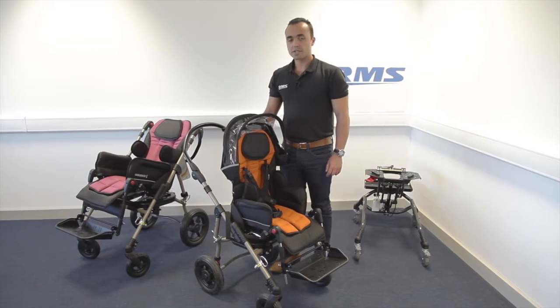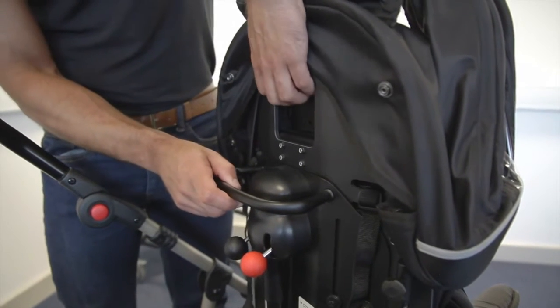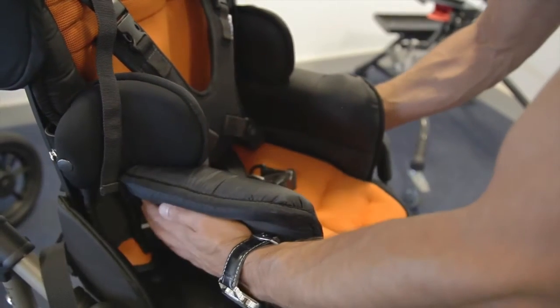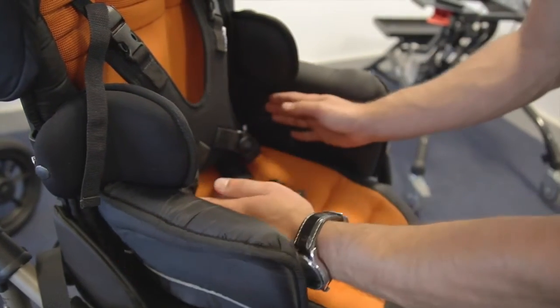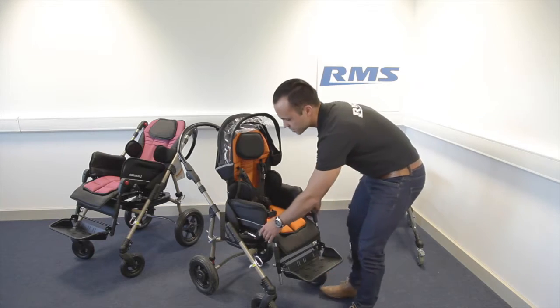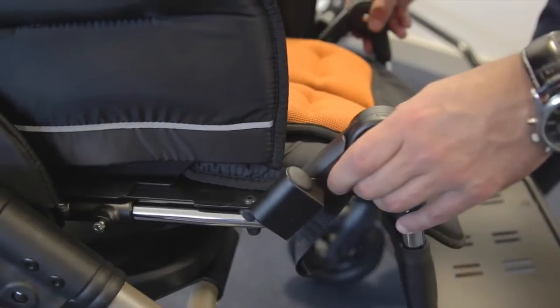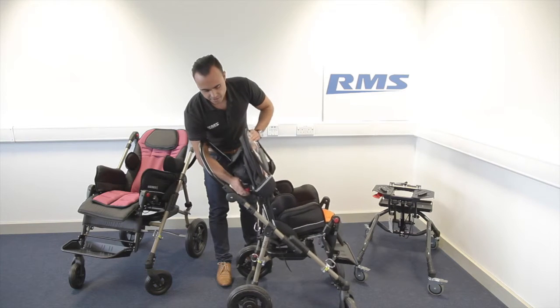It's fully adjustable. You can adjust the bug in height, in width by moving the hip guides, and you can adjust in depth. There are 35 degrees of tilt and space.